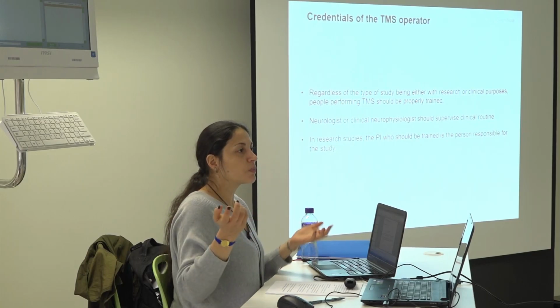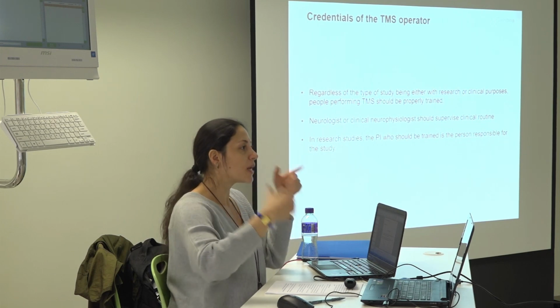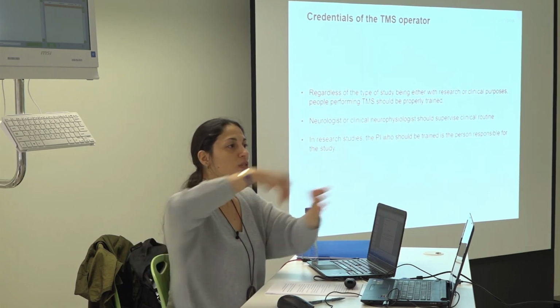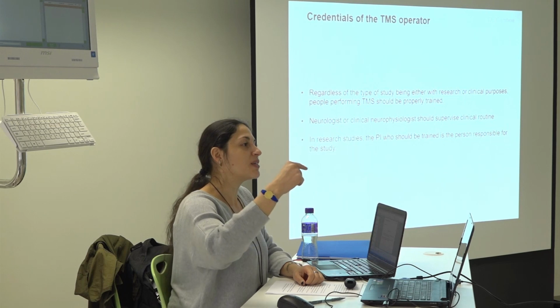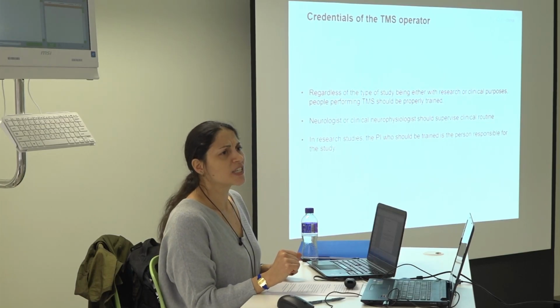So provide training. One way to provide training when you have your students, once you know how to do this, and I would recommend doing that, is to bring two, three people and do three, four sessions before starting your proper experiment. Test with other people. Train between yourselves. Do the test, take measurements, see how it is, and test things. Don't do the experiment straight away, like, okay, she taught me how to put the coil, tomorrow I have my first measurement. No, that's irresponsible. And normally this data is not valid.